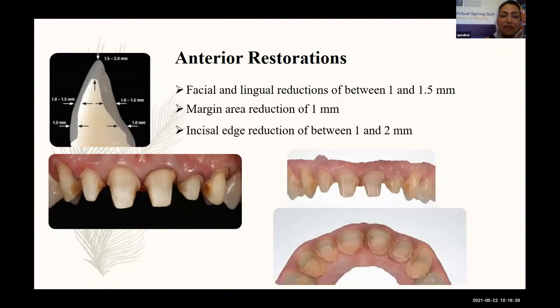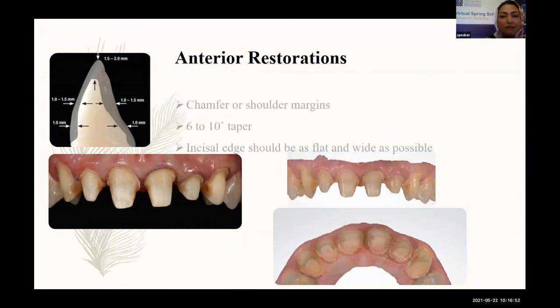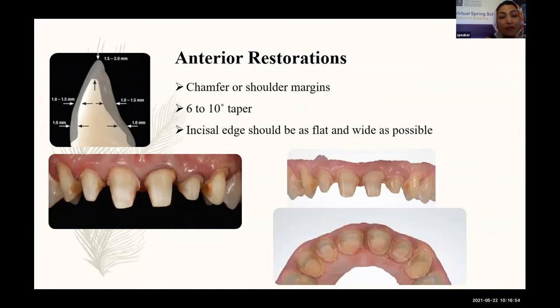This snapshot is about the preparation of the anterior restorations. About the reduction, about the margins, and also the incisal edge should be as flat and wide as possible.